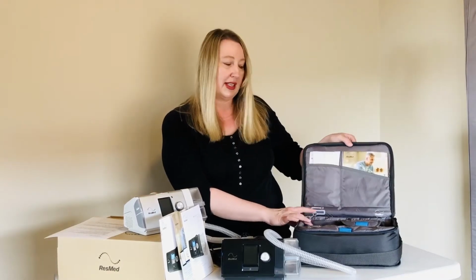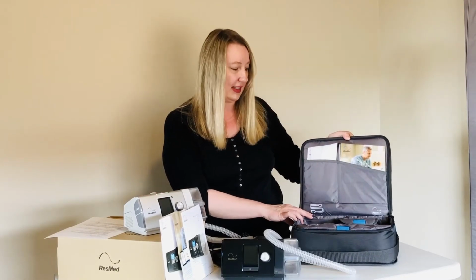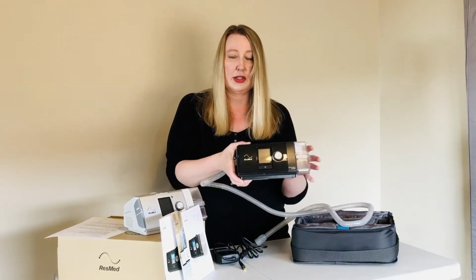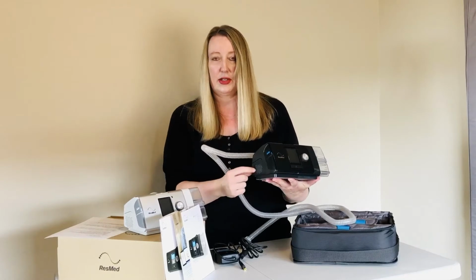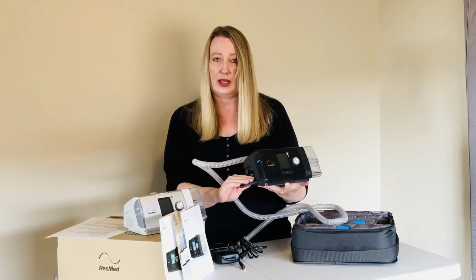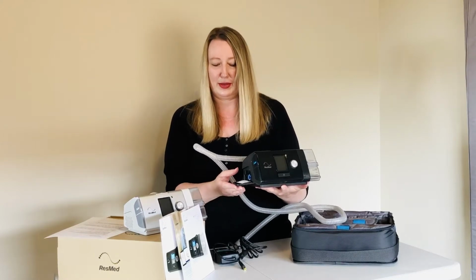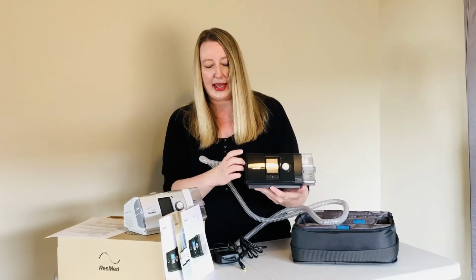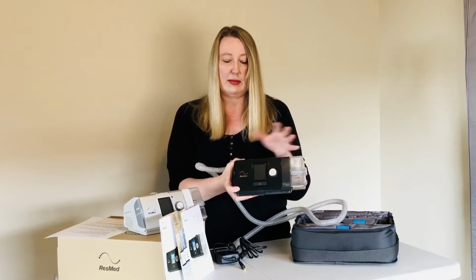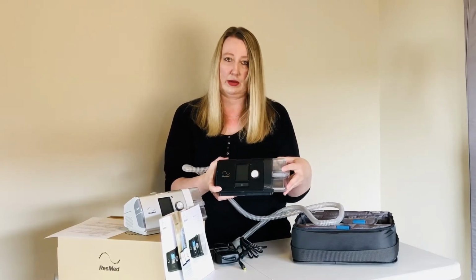Your machine comes with a nice carry case. I've removed the components. This is your CPAP unit. This is your intake. There is one filter. You change it monthly and it can go either direction. It is disposable. This machine has an SD card that stores your data. This is the main unit, and this is your heated water reservoir.